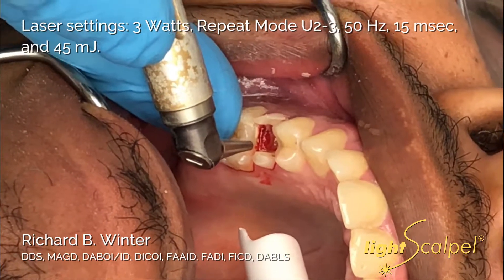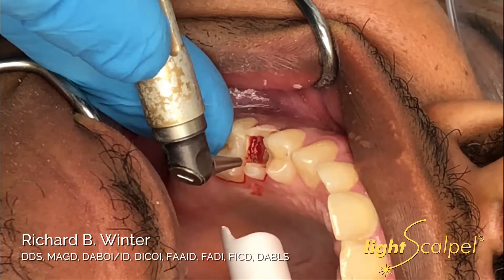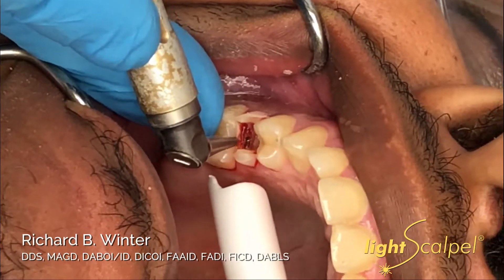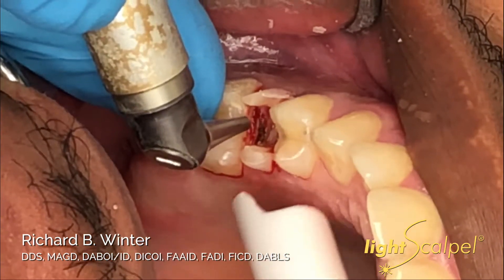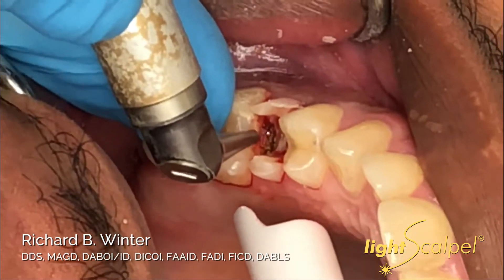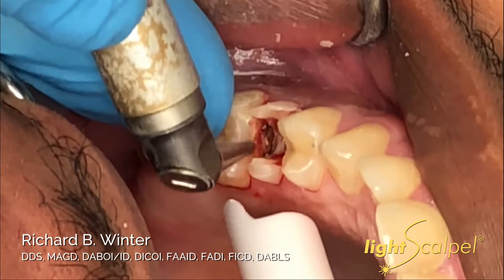We're going to get started now by first removing the tissue circumferentially around the tooth, trying not to hit the remaining tooth structure. Once the laser is all ready to go, you can see how we're just gently removing the tissue between the tooth. Think of this as just erasing the tissue and creating a little trough. Can you rinse that please, Julie?